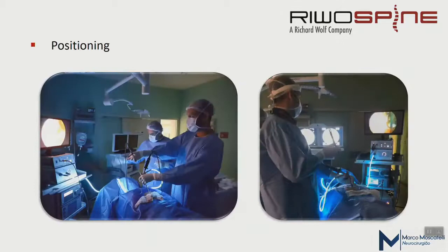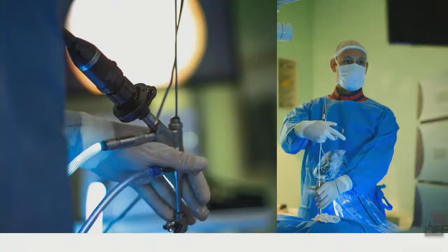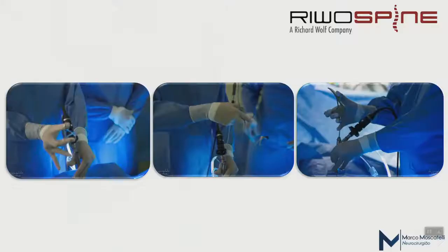This is the position of the surgeon looking at the screen, keeping the arm at 90 degrees and keeping the patient as low as possible. We can see how to hold the endoscope comfortably here in my left hand, and the materials in the other hand. Most of the time, the materials are held in the opposite way to what we normally use in conventional surgery.